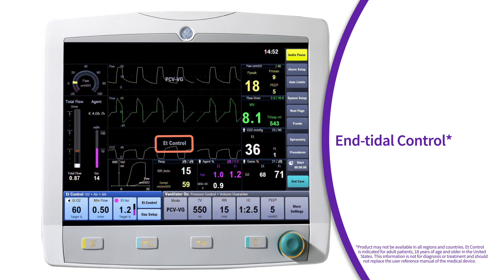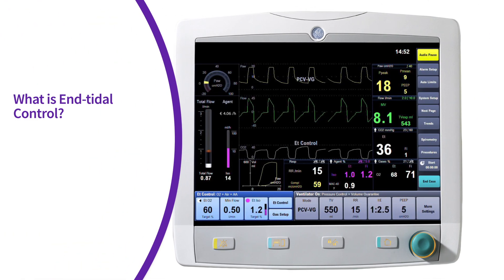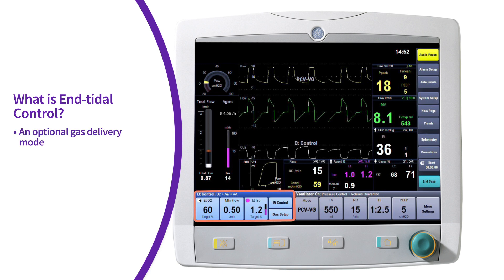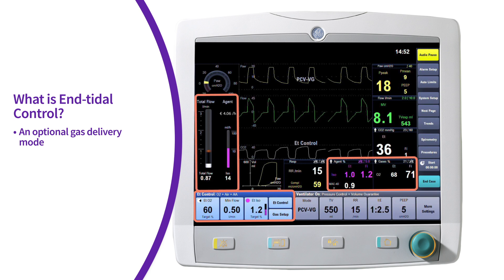Let's get started. What is end-tidal control? End-tidal control is an optional gas delivery mode where the clinician sets the target end-tidal oxygen and target anesthetic agent values. The system monitors the end-tidal oxygen and end-tidal anesthetic agent values and adjusts the gas composition and total flow to maintain the set targets.